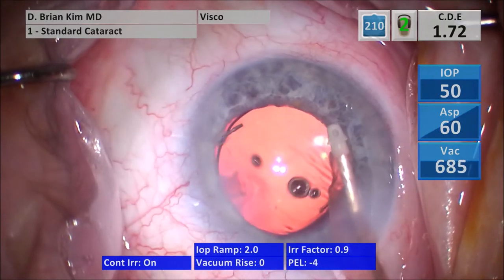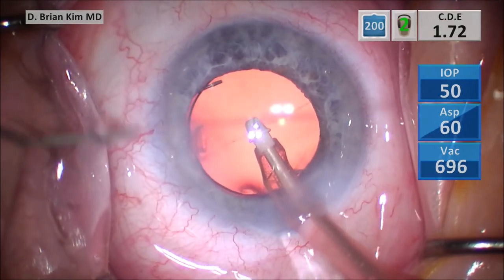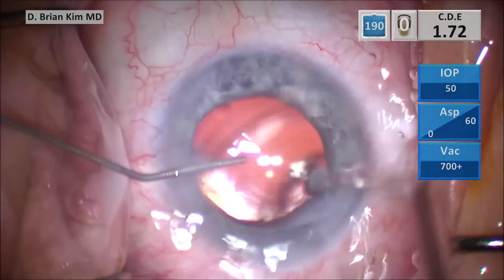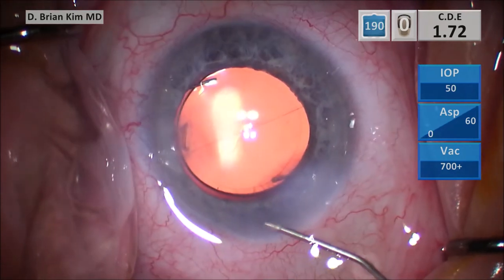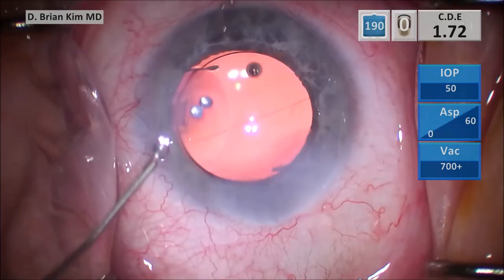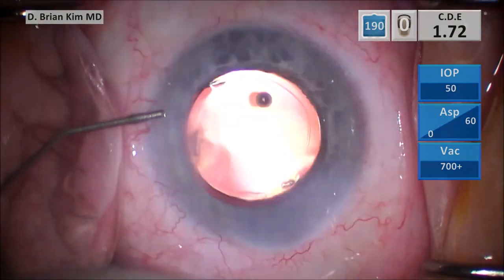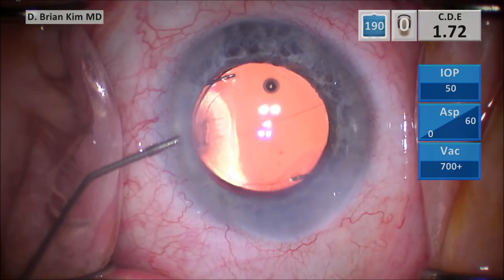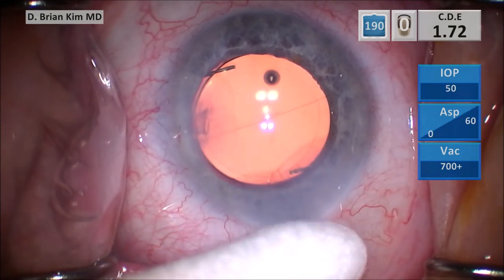Switching to polish mode and then visco mode, removing all the viscoelastic from the anterior chamber, then hydrating my incision. In this case, the second heminucleus was stuck. Rather than trying to torque the bag and stress the zonules, I used the right-angled hydrodissection cannula — the Kim Capsular Fornix cannula. I rehydrodissected, and once it became loose I could see the edge of the endonucleus and literally hooked the lens up just like with a chopper, using the right-angle cannula as a lens manipulator pulling it up out of the bag. With my technique I'm not rotating the lens aggressively — this is a very zonular-friendly way to do cataract surgery, as well as using minimal ultrasonic energy to help protect the cornea and provide a safe and effective surgery.